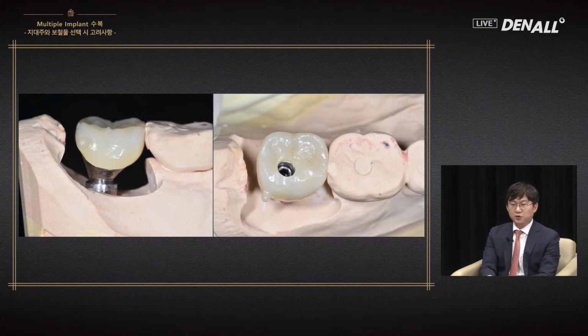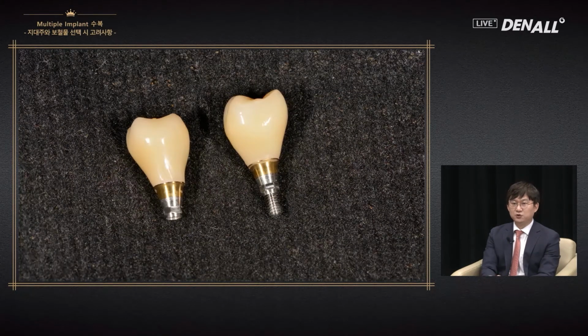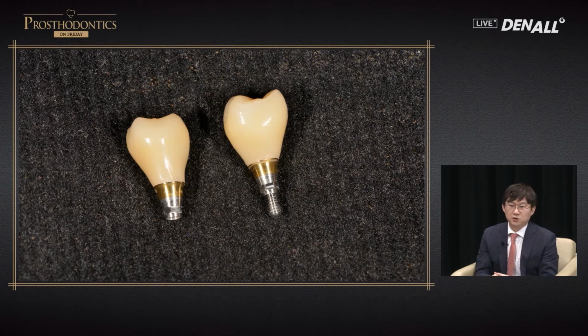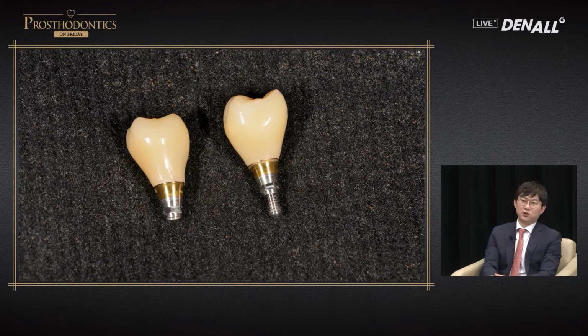That decreases the setting time considerably. There's no time needed for the crown cementation. With accurate impression taking and without error or with reduced error, the delivery can be done within 5 minutes. If the path of the implant is not appropriate, if there is a contact problem, we cannot apply this approach. If the implant path is proper, I use this approach quite a lot these days.